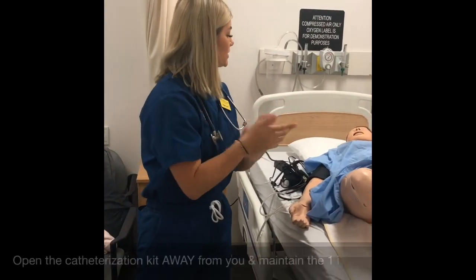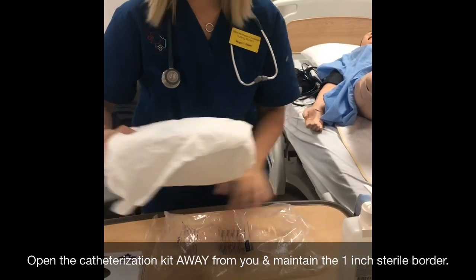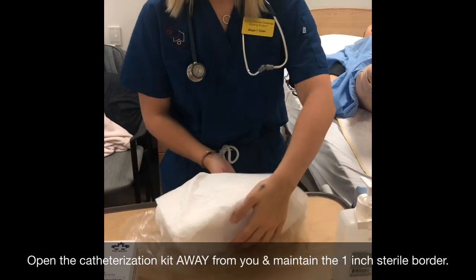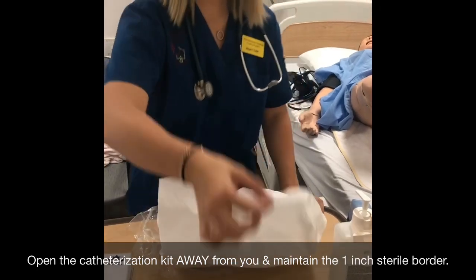And now, Mr. Mancini, I'm just gonna put my catheter kit in between your legs. Or sorry, before I do that, I'm gonna open up my catheter kit and I'm going to open it up away from me. And I'm gonna make sure to maintain a 1-inch border for the sterile field.